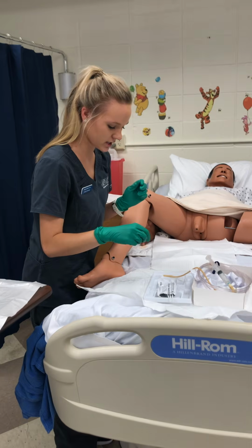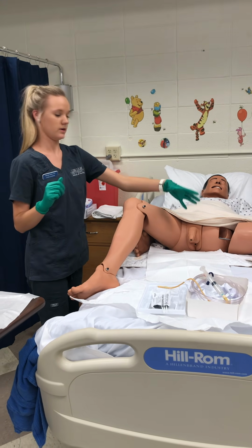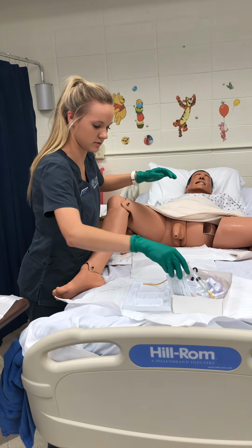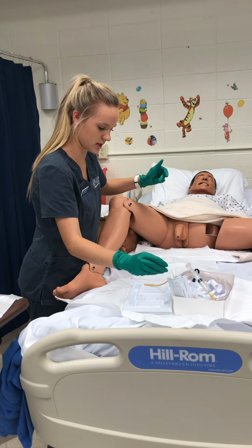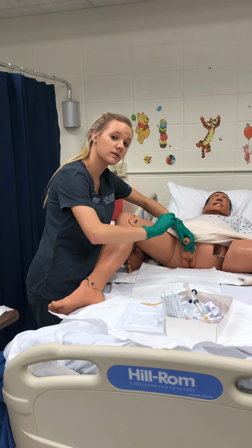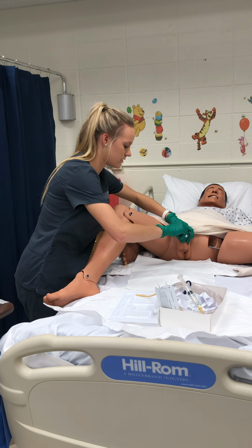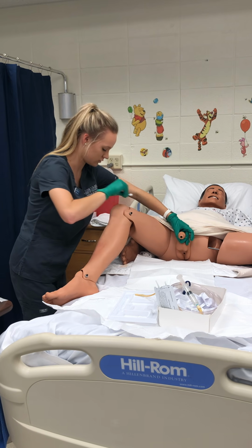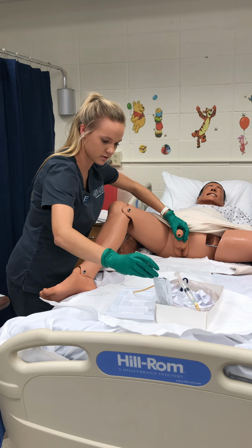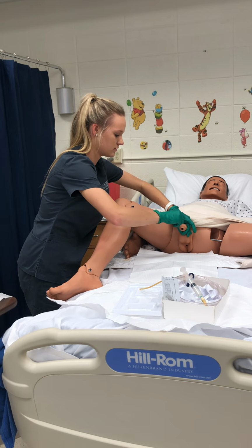Okay, so now this hand here is going to break sterility because I'm going to hold the penis while I clean it. So I'm gonna do the same thing as I did when I cleaned it. And I'm going to start at the top of the urinary meatus and work my way down in a circular motion, making sure not to contaminate my sterile field. I'm going to do this 3 times.